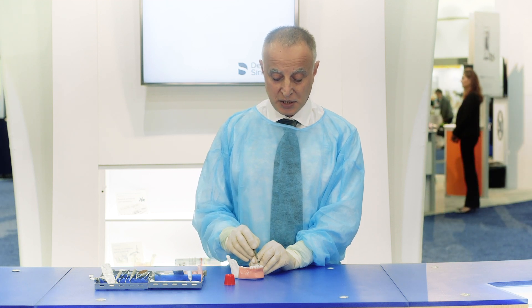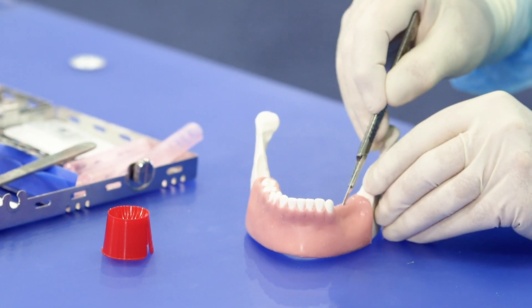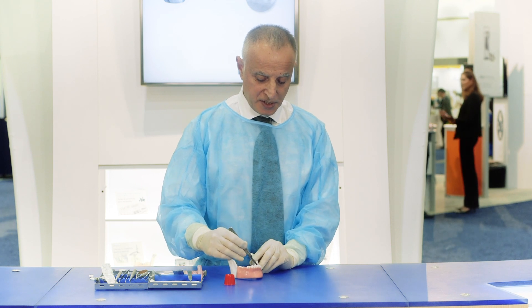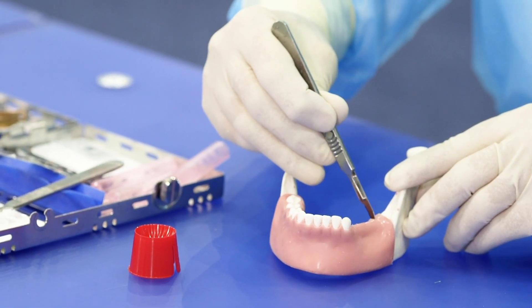The first thing that we do is a mid-crestal incision. In most cases, we are going to need some vertical release incisions on the mesial and the distal aspect.